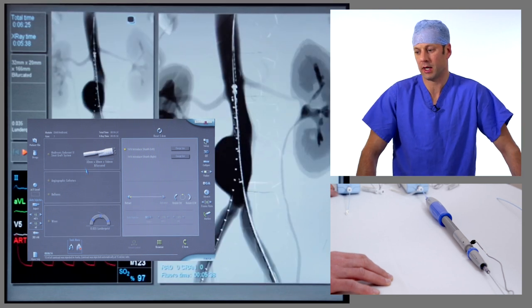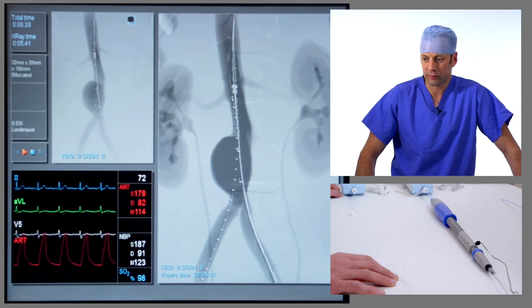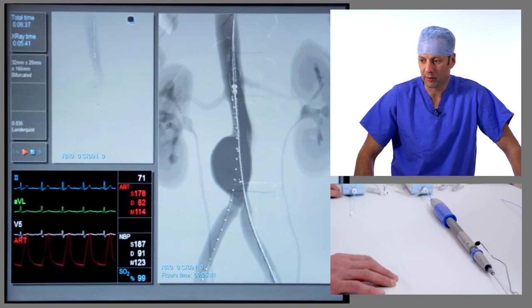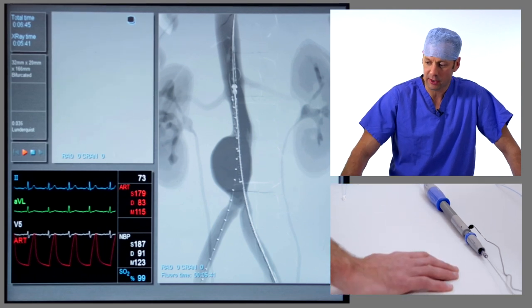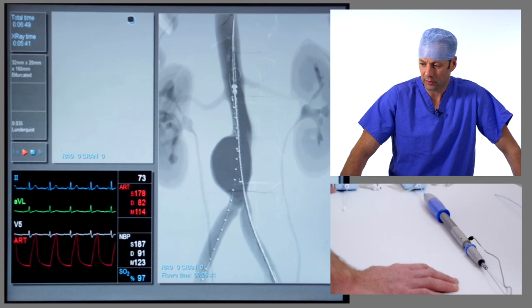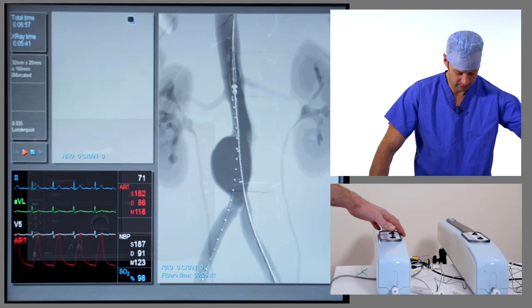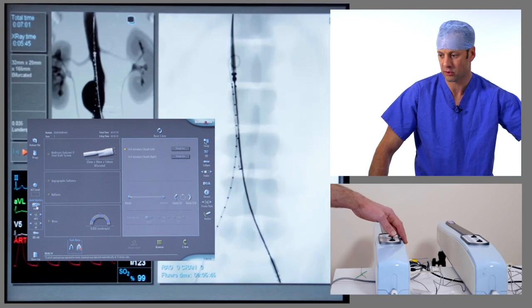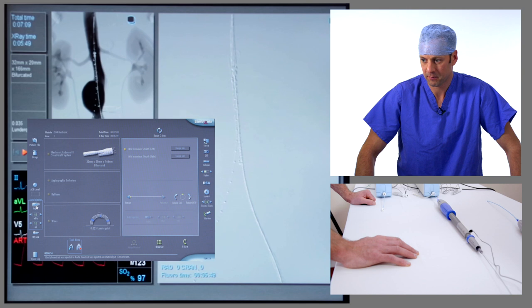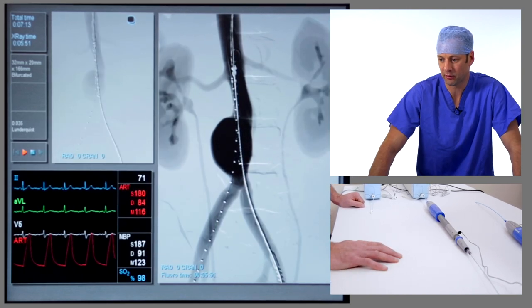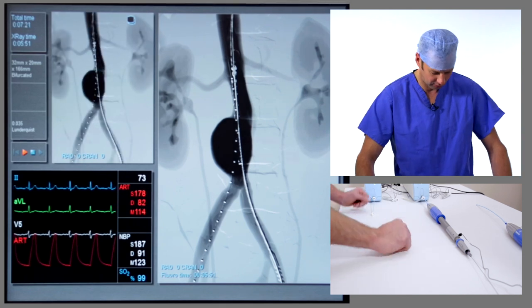We can now see the subtracted image on the main live monitor. When we screen, we get a little bit of overlay fade. You can see the lowest renal artery is the right hand renal artery, and we can see the covered markings at the proximal end of the stent graft immediately below the right renal artery. We can also see the iliac bifurcation on the patient's left, and the stent graft will open above that. We'll repeat the run with the image centred a little more distally to confirm the iliac artery, since this is a two-piece system. There we get a better view of both the renal artery and the patient's left iliac bifurcation. The graft is in a nice position and the rotation is correct, so we can start to deploy the stent graft.